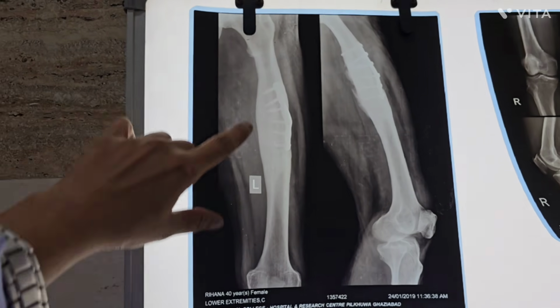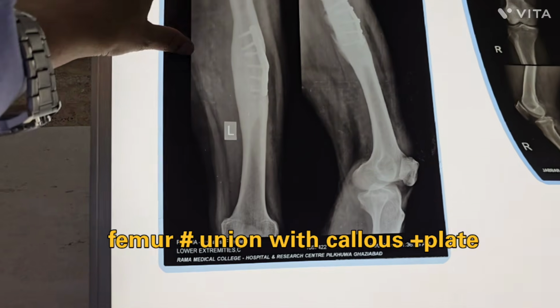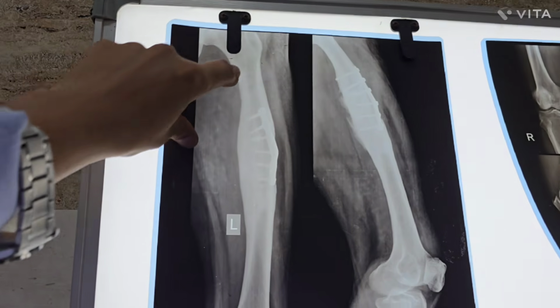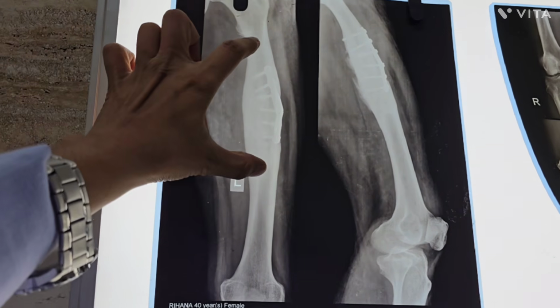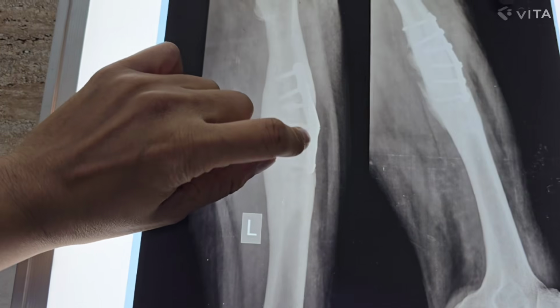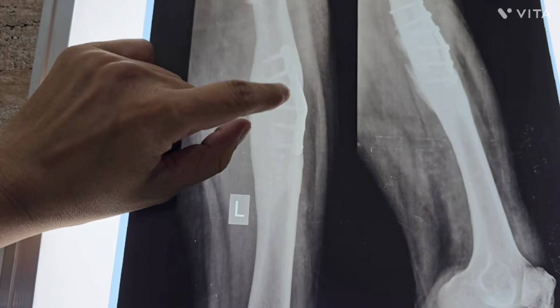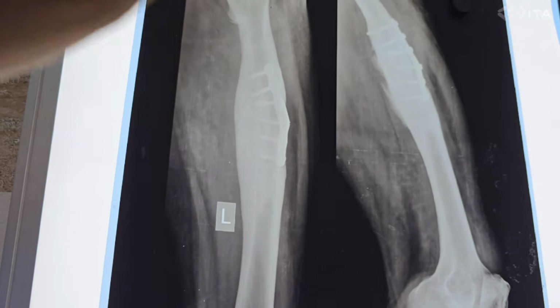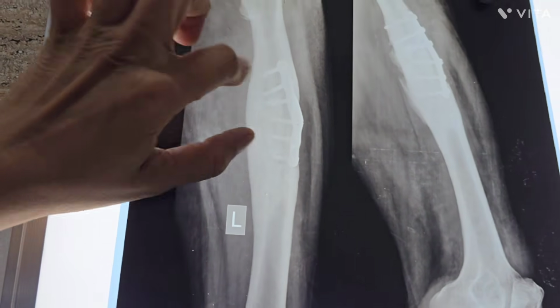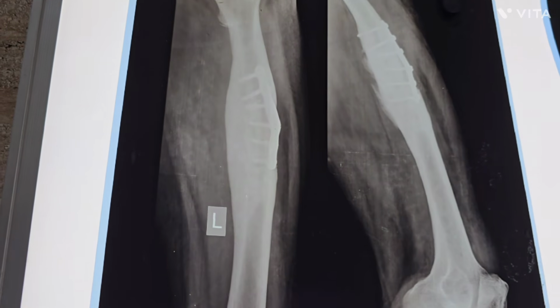The next one is the femur. This is the head, the greater trochanter, the lesser trochanter, and this is the diaphysis of the femur. You can see an implant inside this bone. It means the implant is very old. The implant is fractured, the implant has failed. The bone is united, with huge callus formation around the fracture site.